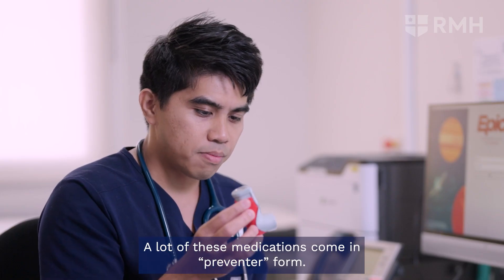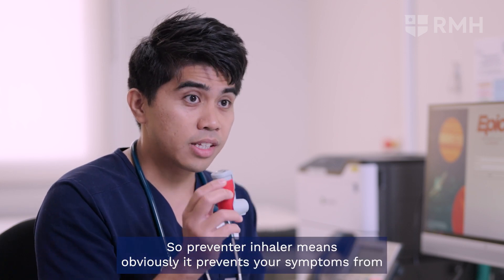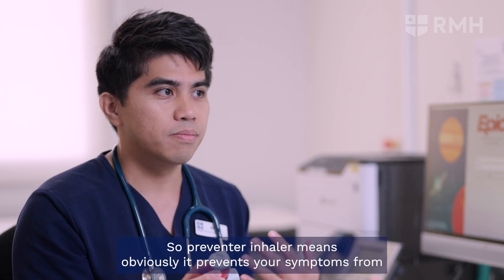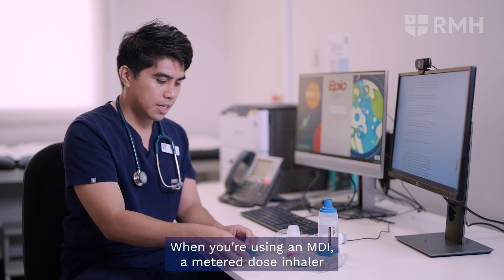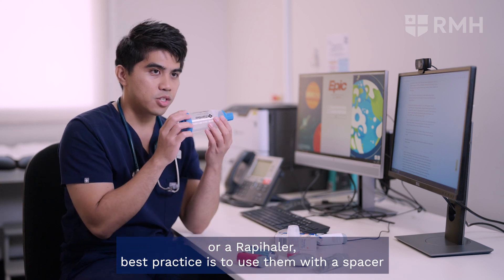A lot of these medications come in preventer form. A preventer inhaler obviously prevents your symptoms from worsening or the onset of your symptoms. When you're using an MDI — a metered dose inhaler or a Rapihaler — best practice is to use them with a spacer.